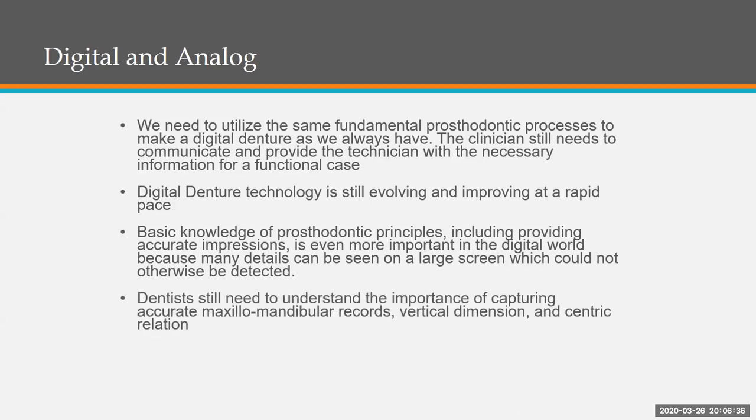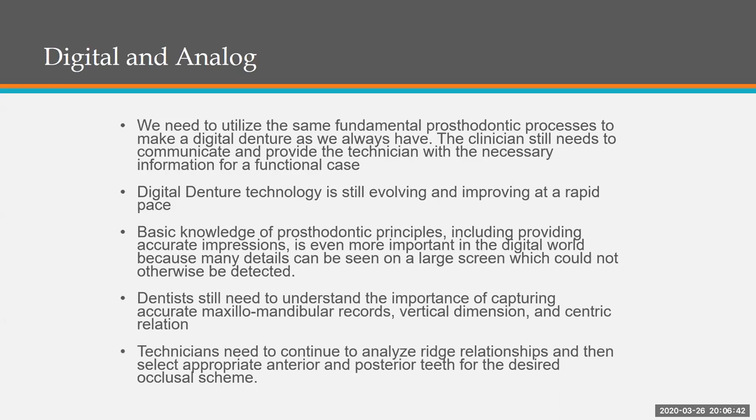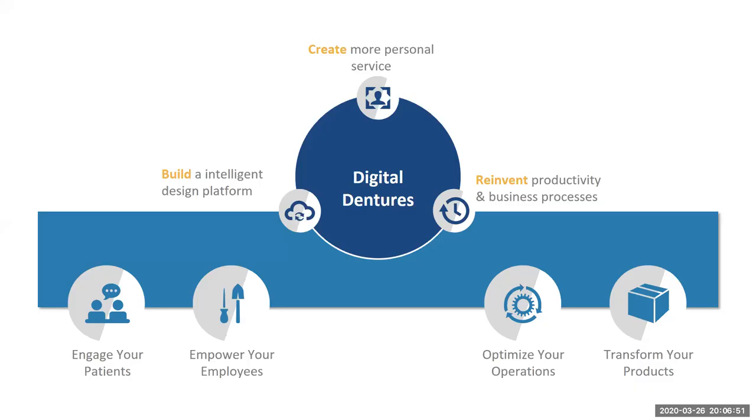Dentists still need to understand the importance of capturing accurate maxillomandibular records, vertical dimension, and centric relation. And the technicians still need to continue to analyze ridge relationships and then select appropriate anterior and posterior teeth for the desired occlusal scheme.